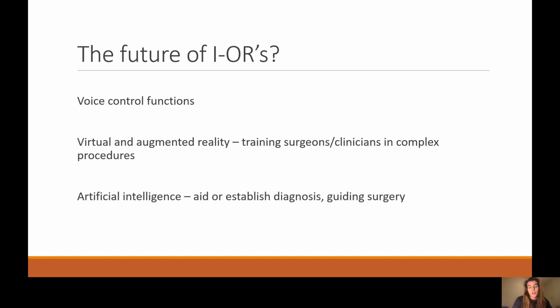So in terms of looking at the future of integrated theatres, voice control functions are something that are currently being used in some theatres, and this would be beneficial for the surgeon, meaning that they wouldn't have to touch anything outside of the sterile field, and they would simply be able to speak the command and the system would be able to respond. There's then virtual and augmented reality.